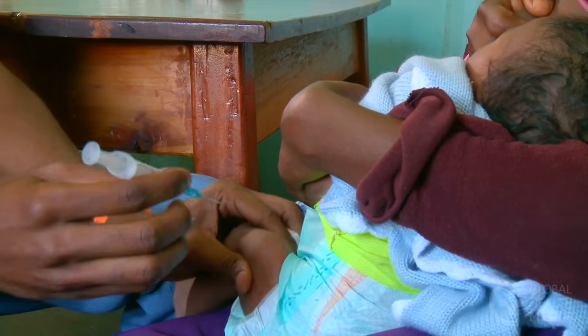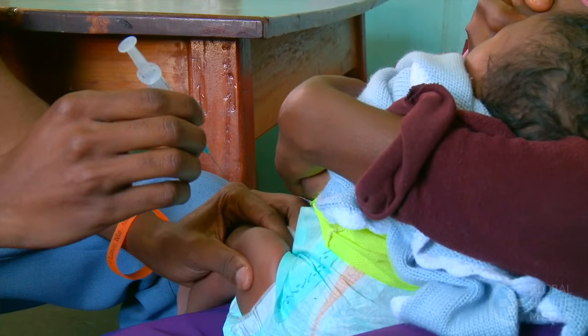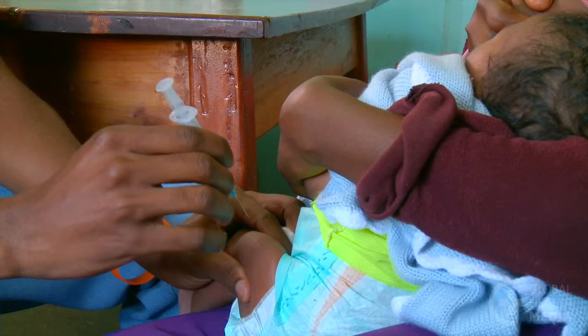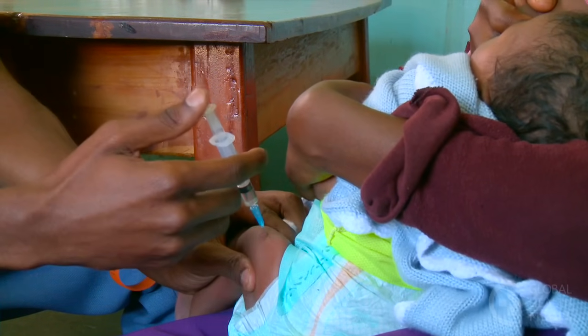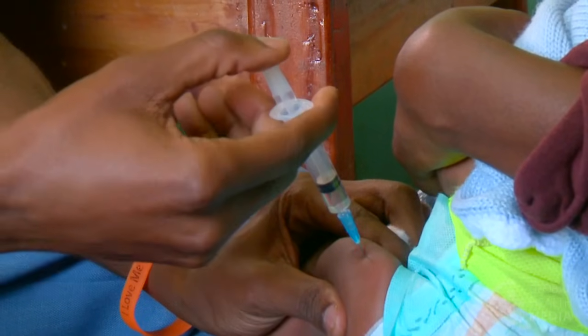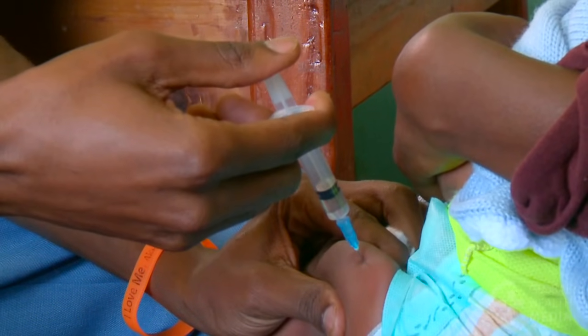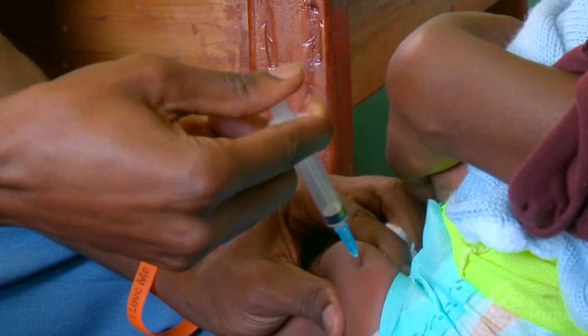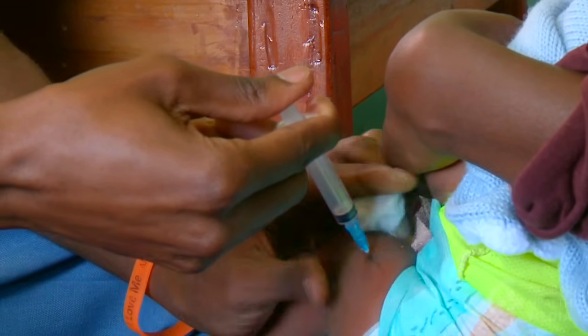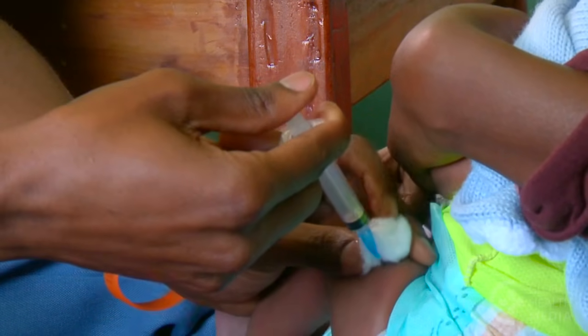Hold the baby's thigh firmly throughout the injection. Then, with one quick motion, insert the needle at a 90-degree angle straight into the outer thigh muscle. Inject steadily.